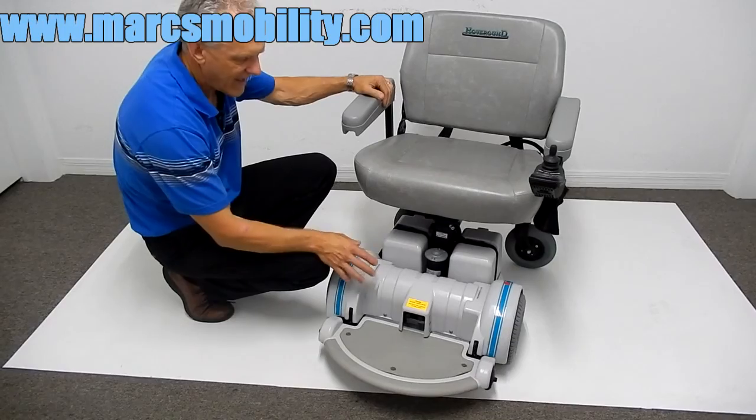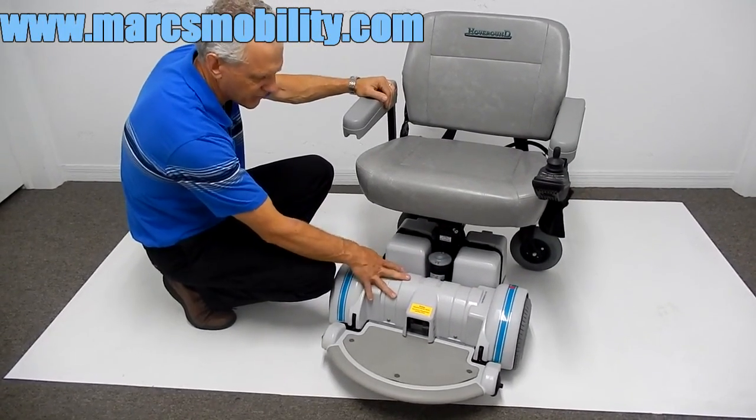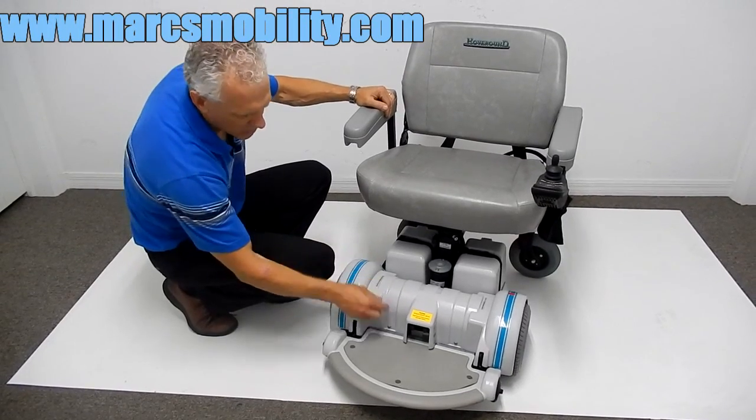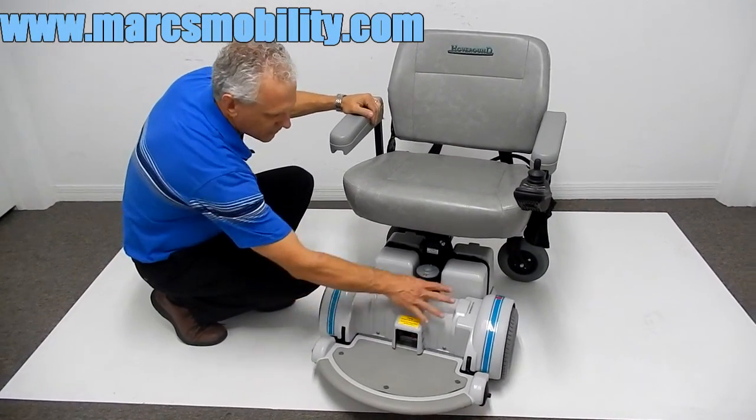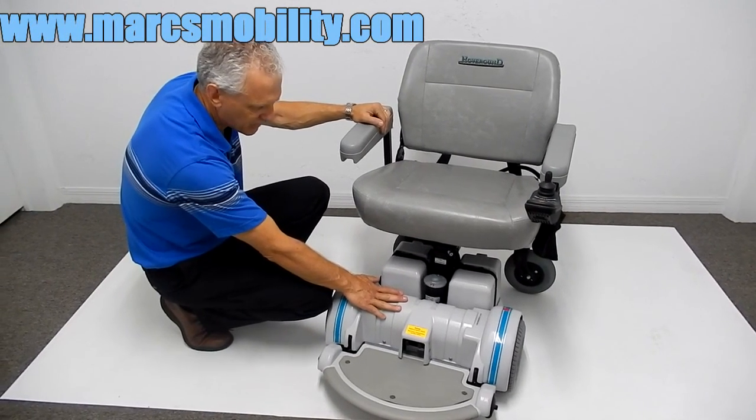This Hover-Round has the old Hover-Round motors — these are the most powerful motors they ever put in the Hover-Round chair. You can see by the rounded shape that those are the heavy-duty motors, the same motors they put on their 450-pound power chairs.